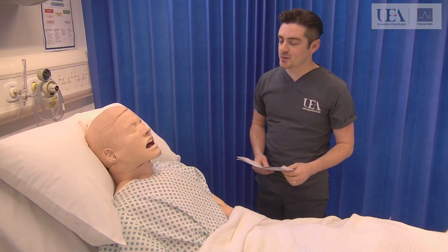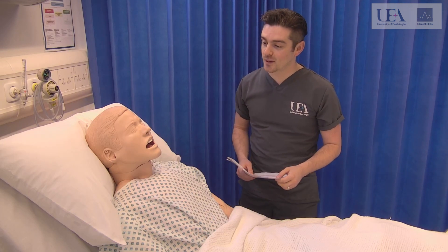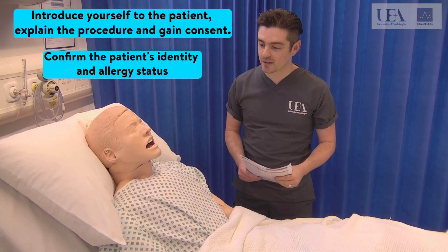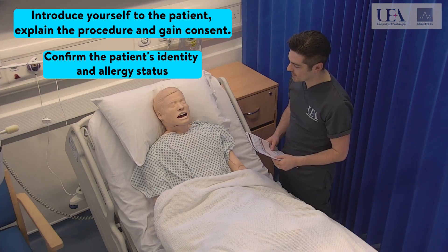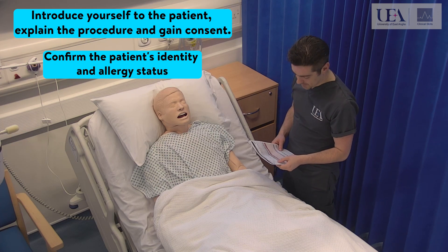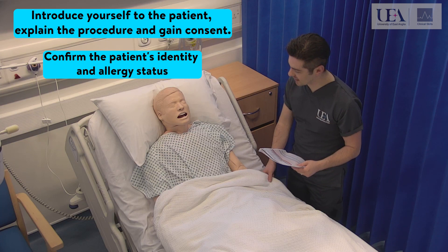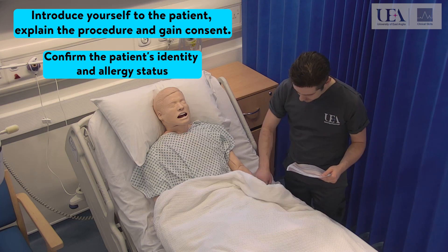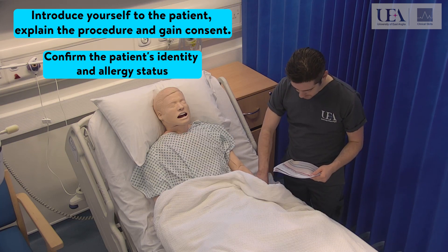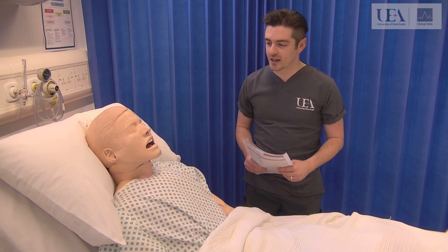Hello, my name's Ben. I'm one of the nurses on shift today. The doctor just asked me to come and give you an injection in your abdomen — would that be okay? And what's your date of birth for me? I'm just going to check your wristband as well if that's okay. Yep, that's all good. I'll go and prepare the injection now.